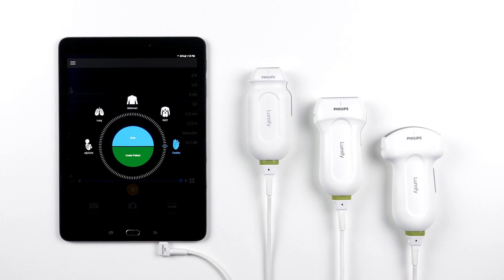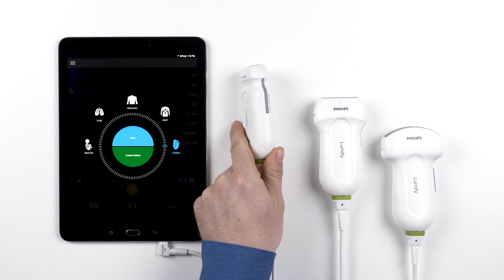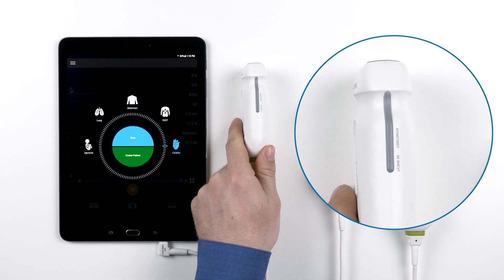Next, let's get oriented with the transducer. This grey extrusion on the side of the handle is your orientation marker. This corresponds with the orientation marker on the ultrasound image.